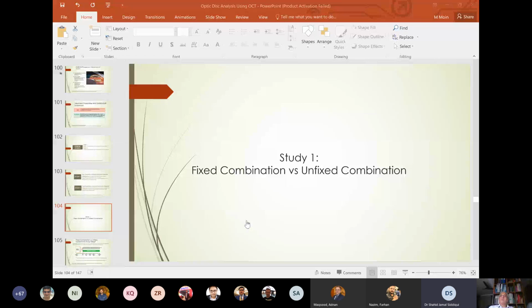One comment from my side: although it was a very nice presentation, we are all aware that in the advanced stages the visual field examination is much better, but to diagnose glaucoma in the early stages, the OCT is required.